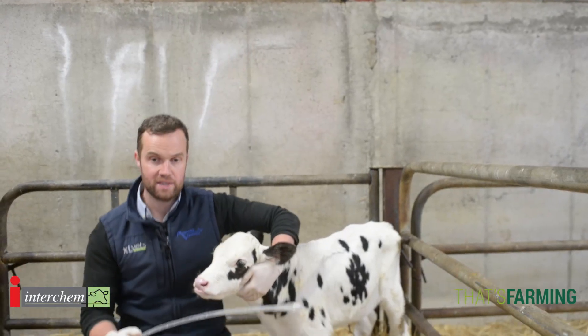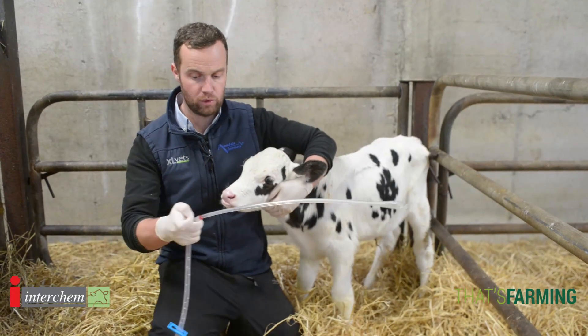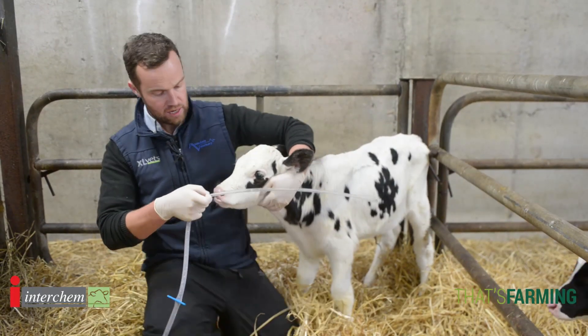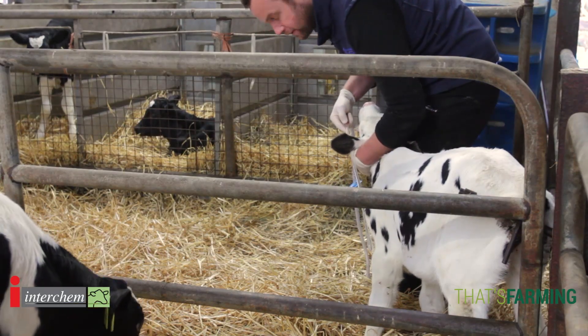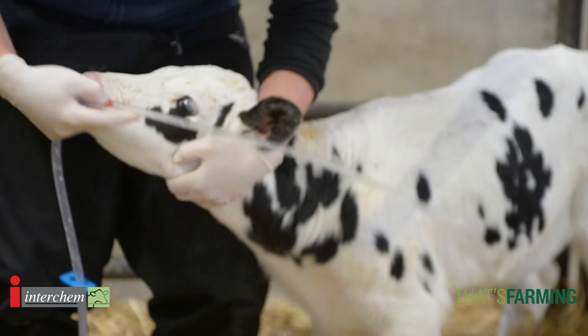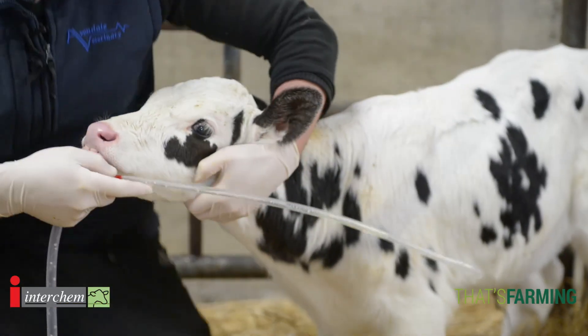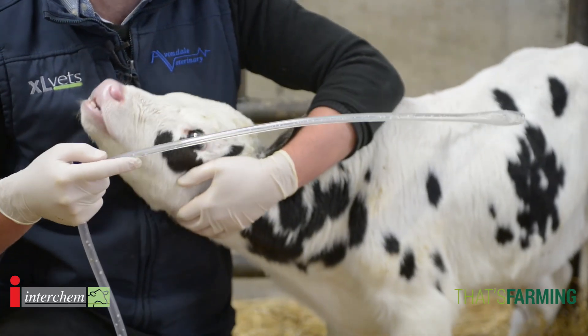One thing before we place the stomach tube is to know how far to put the stomach tube in, and a simple rule — I've marked it here in red — is that from the tip of the nose to the elbow is about the length that the tube needs to go in. Some tubes are marked but you can also mark it yourself. That's a general rule: from the tip of the nose to the elbow is the length the tube is inserted in the calf.